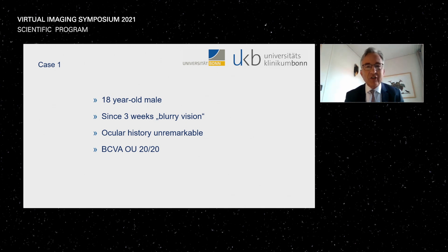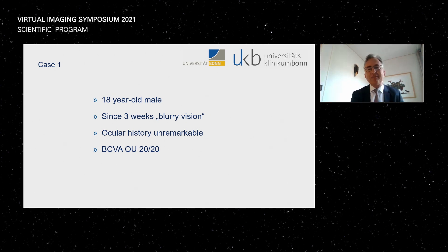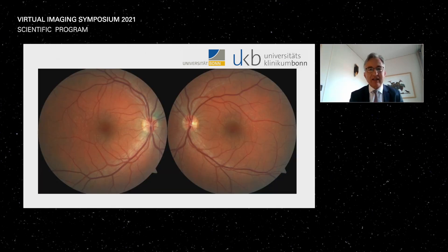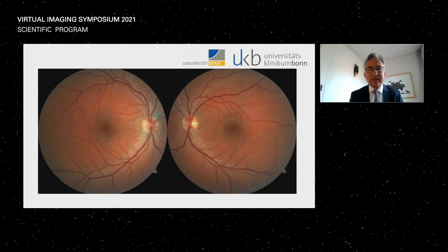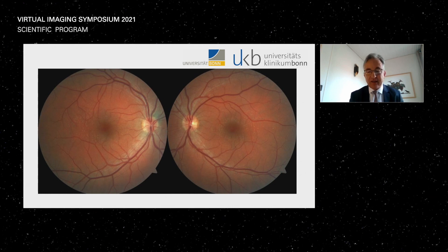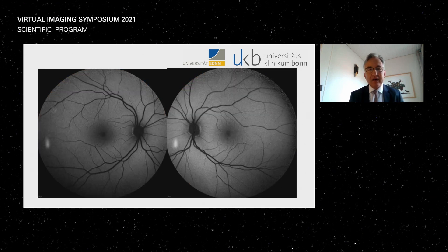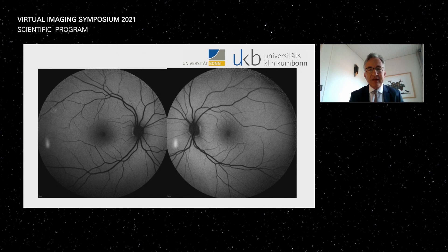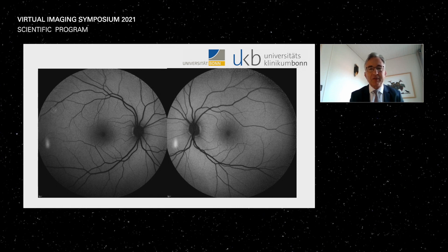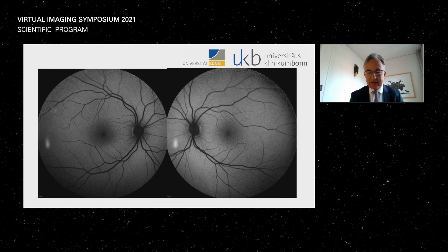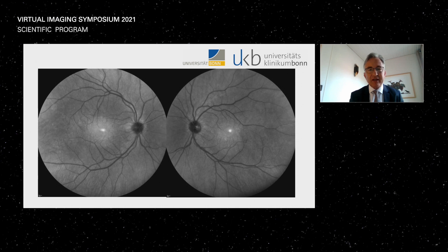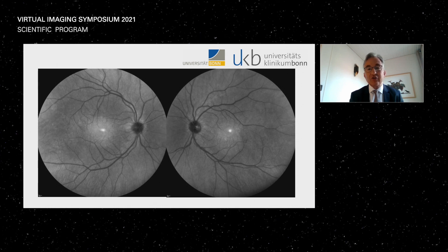An 18-year-old male with good visual acuity but some complaints of blurred vision. The fundus image looks very innocuous. The fundus autofluorescence shows normal distribution of luteal pigment, and the infrared reflection image also looks normal.